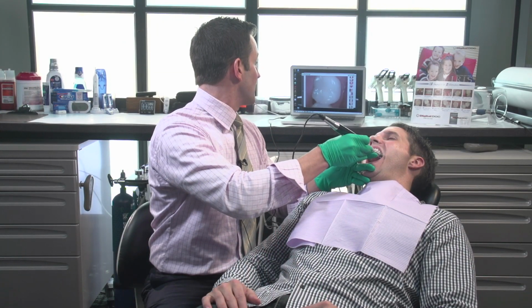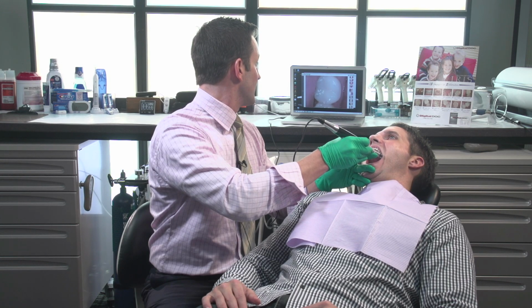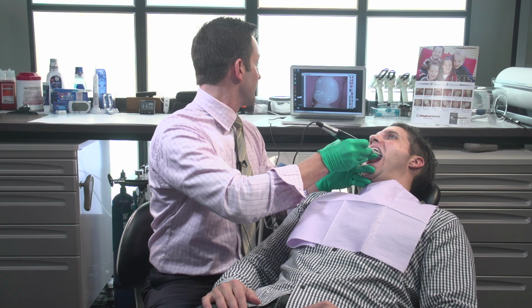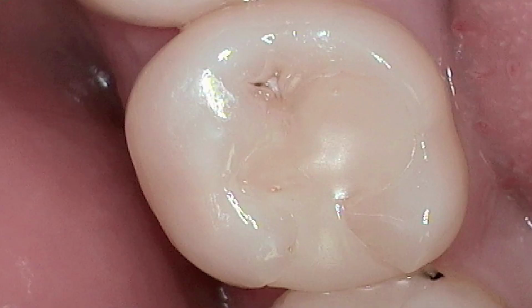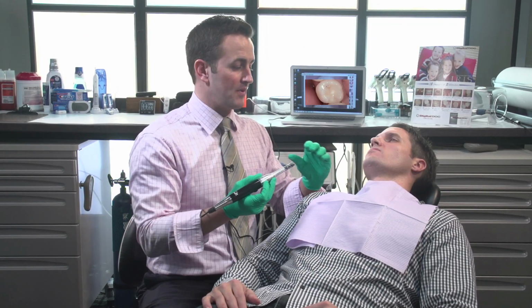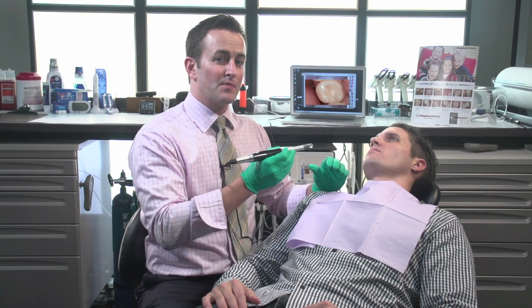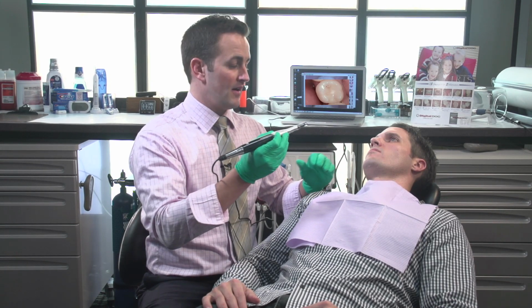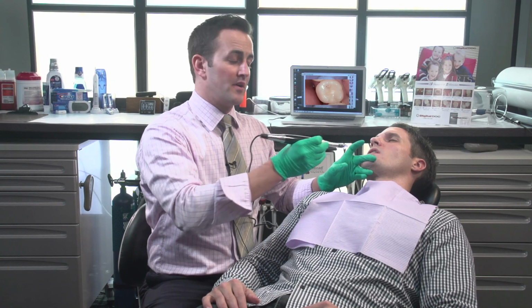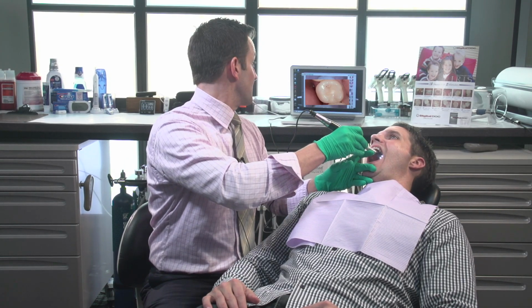You have the patient open and close once again to find the desired focal range. Open up for me. All right. Here we have a good image, but let's go ahead and play devil's advocate again in this scenario. Say a patient that's maybe a pediatric or can't hinge properly. Due to the curve of Spee and curve of Wilson, we're not going to position the camera on the buccal side of the upper arch. We're going to put it on the lingual side to give you additional depth of field. Go ahead and close down for me briefly.